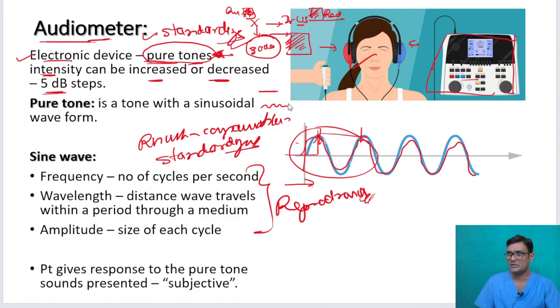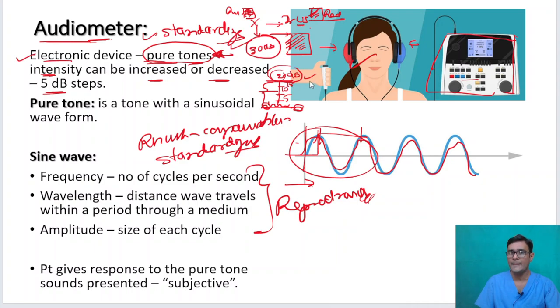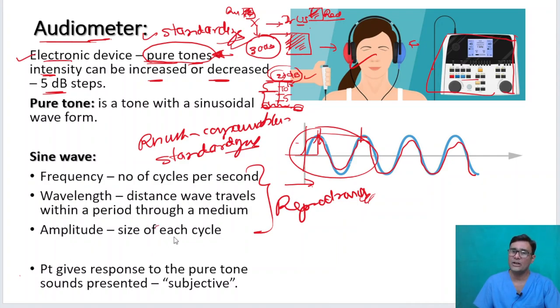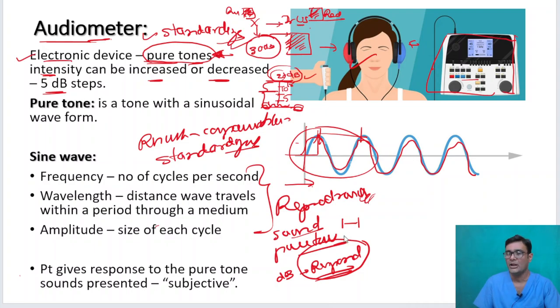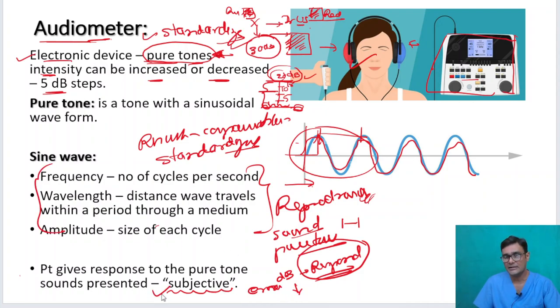At a particular frequency, I give the sound to the patient. At 0 decibels — can you hear? No. At 5 — no. At 10 — no. At 15 — no. At 20 — yes. So 20 decibels is the threshold at which the patient is able to hear. This is the basic objective of audiometry. Always remember this is not 100% accurate because the patient has to respond to your sound, making it a subjective test.